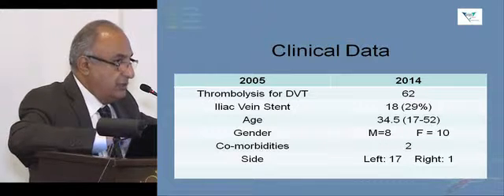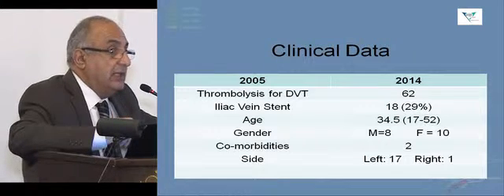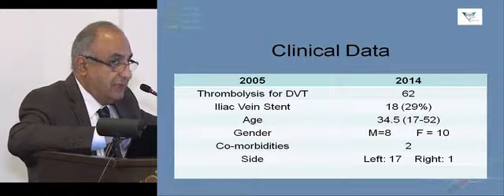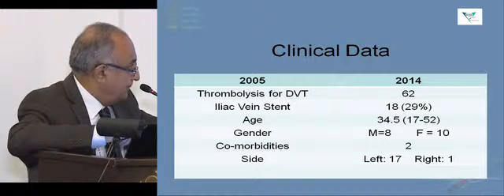We follow up the patient with duplex ultrasound twice a day, that's every 12 hours, until the thrombus is completely lysed. And then we perform completion venogram to document the result and also to assess the iliac vein for stenosis. And if there is stenosis, we use a stent.